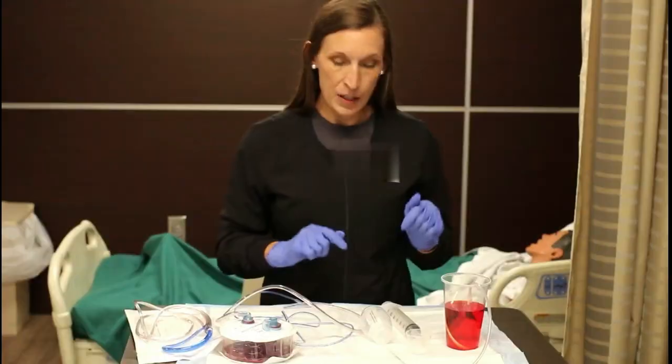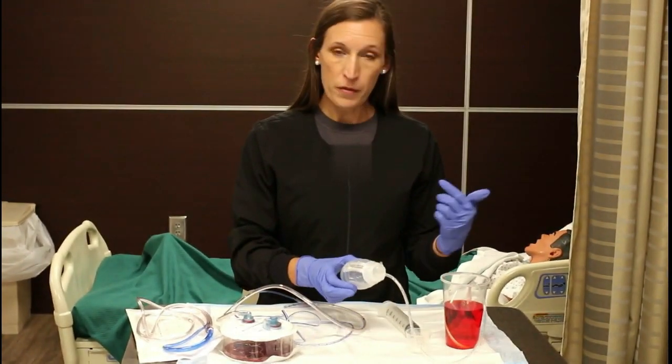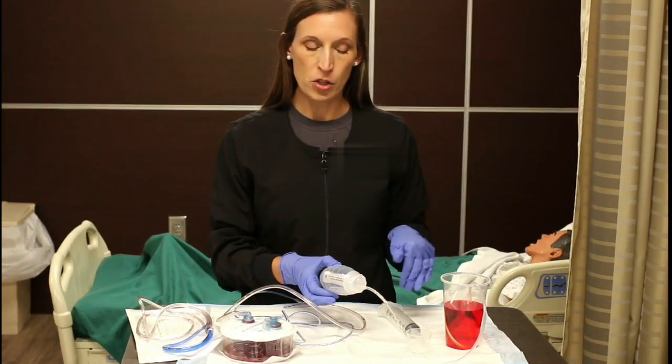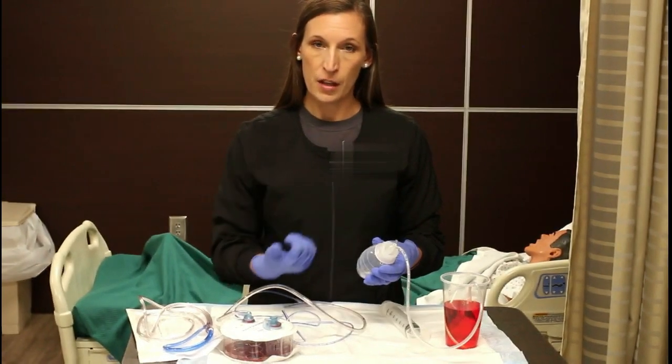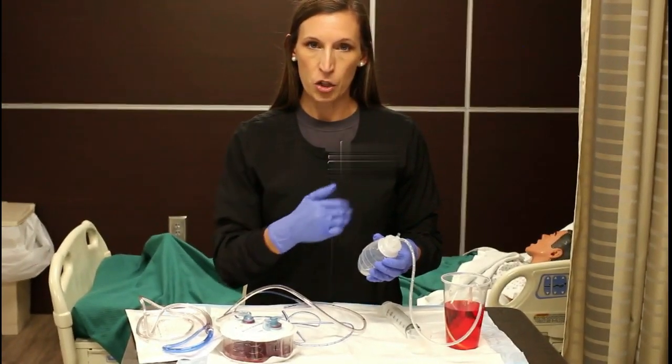The next thing I'm going to show you is a JP drain. JP drains are inserted into patients who've had surgery and are having a lot of extra drainage and fluid from that surgery. It will help create suction on that area and drain it so it doesn't accumulate in the body.